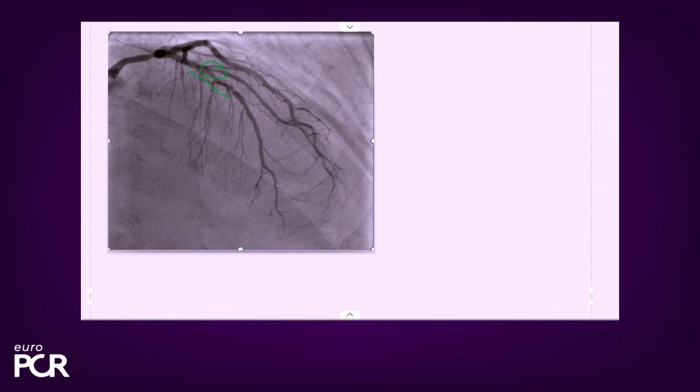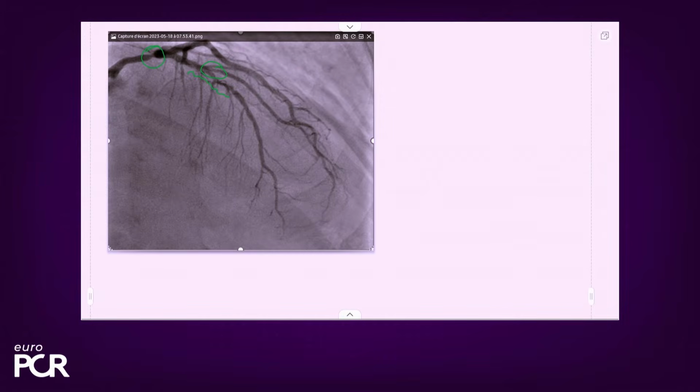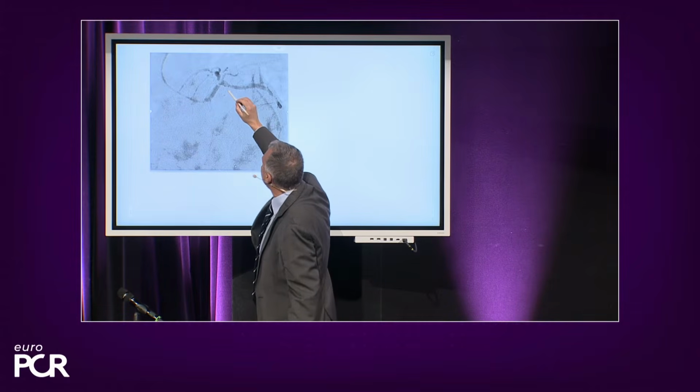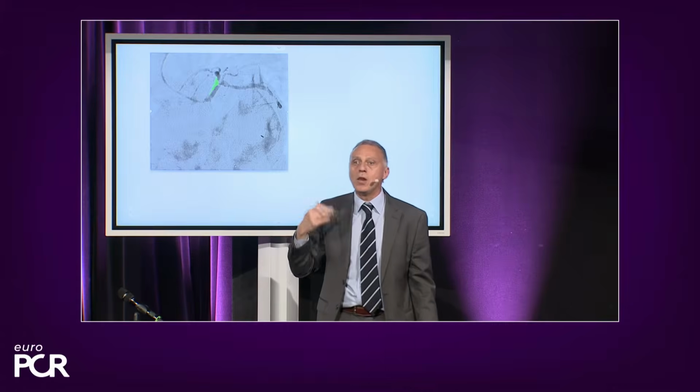Here, I see in this view that there is the tightness of the disease. It is apparent in the distality, so there is definitely a huge plaque over there. But when you go in the cranial view, what you see is the fact that the plaque seems to be distributed like that, jeopardizing the ostium of the LAD coming from the lateral wall, while on the opposite, toward the circumflex, I do not expect to have a lot of disease.